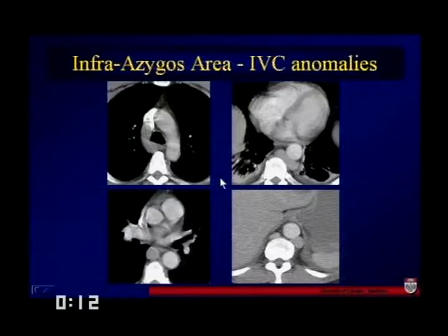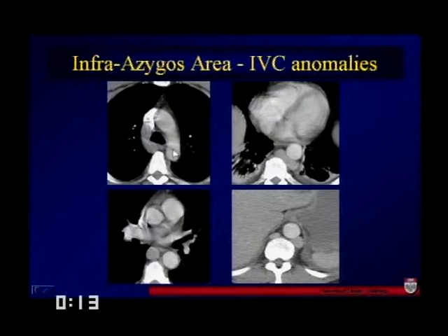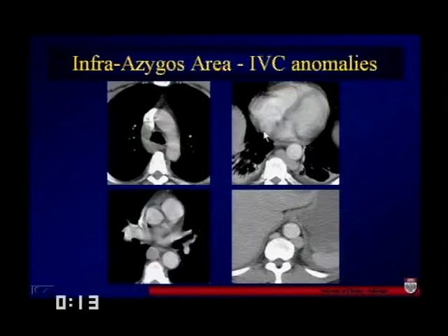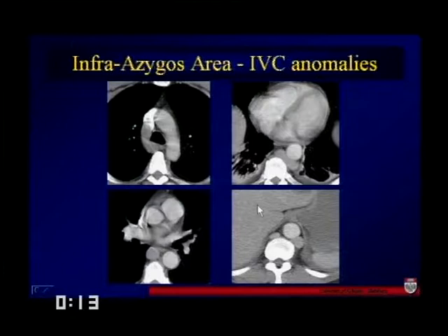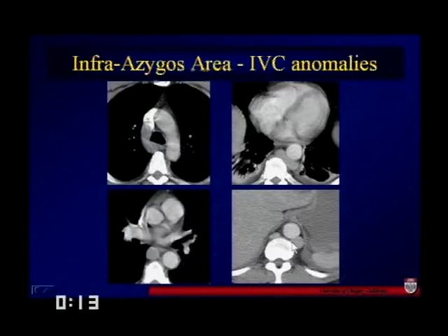Here we can see some IVC anomalies. We have a very distended azygous arch, and as we go inferiorly, we don't see a well-defined IVC. What we do see is azygous and hemi-azygous, very thick azygous and then nothing in the liver, but a very well-defined azygous system in the upper abdomen. This is a case of IVC interruption with azygous continuation.